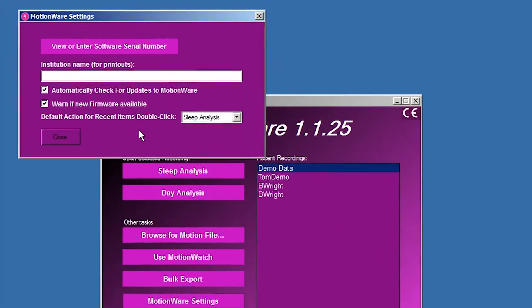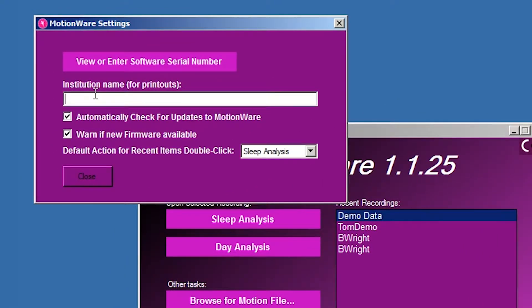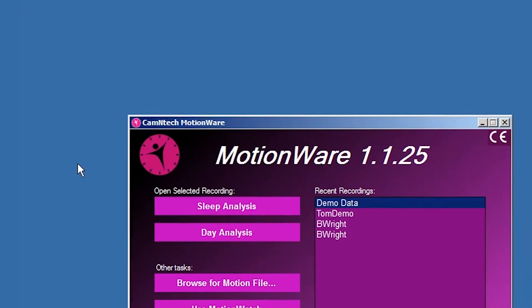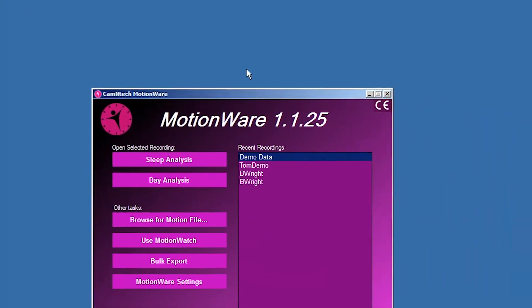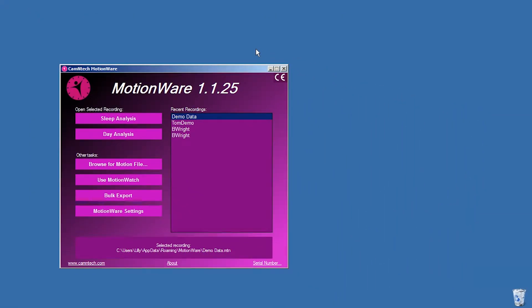You may choose to enter an Institution Name in the Settings window which will then be included near the top of all printed reports. This may be desirable if you wish to hand the Actogram or other reports directly to the participants after use.